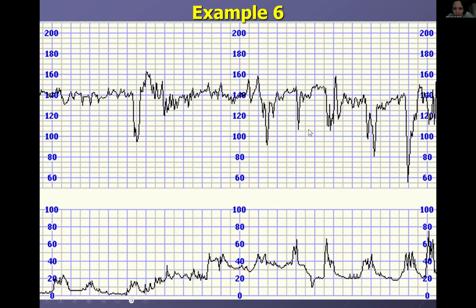And then if you look at this one, right? This looks like late because the peak comes before the trough, okay? And then this one, yeah, this also has a bit of a late component. This one is right with the contraction.